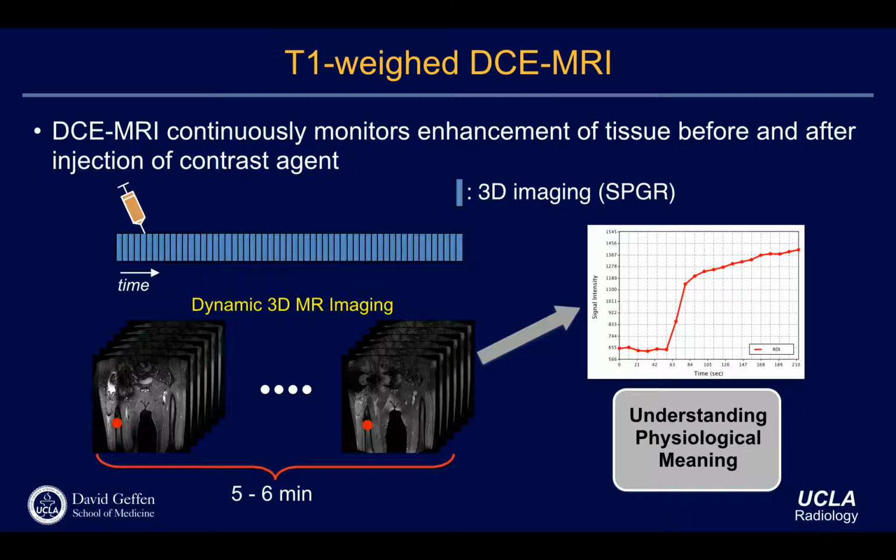Okay, and will the contrast stay in that tumor site, or will it just go? We're going to talk about it later. Yeah, that's a great question, right? That way you can somewhat understand the tumor characteristics. Some tumors may retain the contrast agent longer, or some tumors may take the contrast agent very rapidly but then spit it out very rapidly, right? It depends on the biological status.